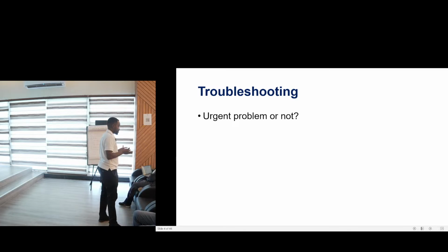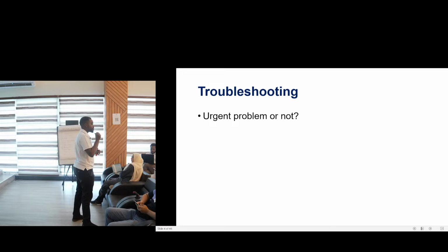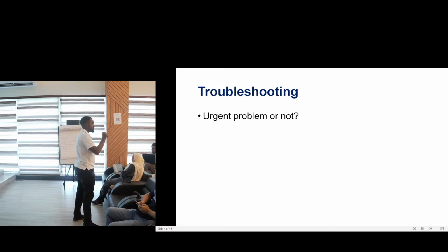So we all agree that we are the main monitor for our patients. You will be able to observe your patient. How is your patient responding? How is the ventilator responding? And what are the monitors showing you? Every single time, keep in the back of your mind that you are the principal monitor of your patient.